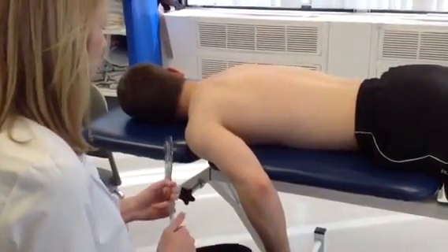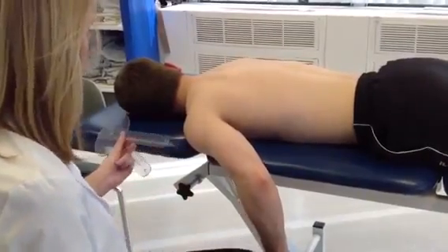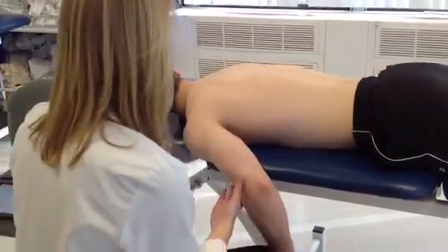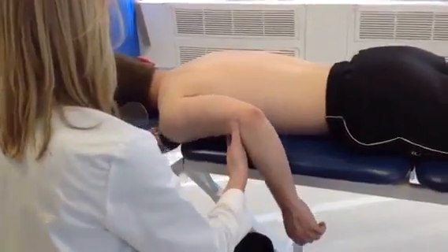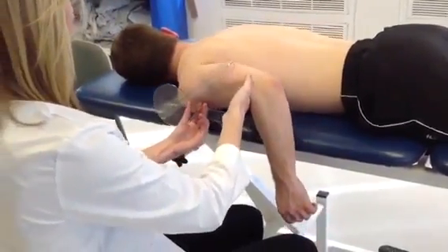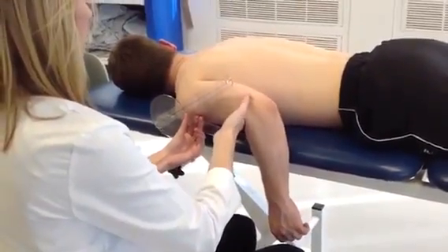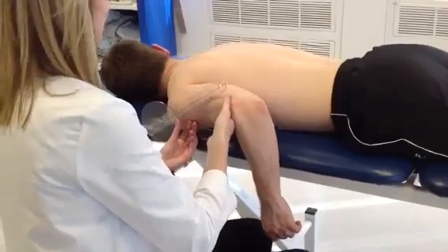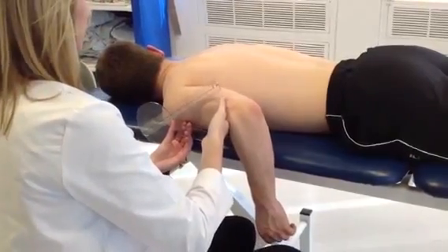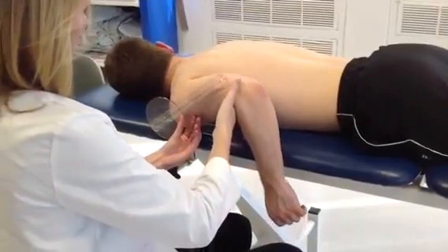Okay, Steve, so this time I'm going to do the same measurement that you just did on your own. I'm going to do it for you. So if you'll just relax your arm into my hand, and I'm going to line up my goniometer the same way that I did for the active range of motion test. And I'm going to be watching for any trunk movement, and that's when I'll stop and take the measurement. So I'm going to lift up your arm.